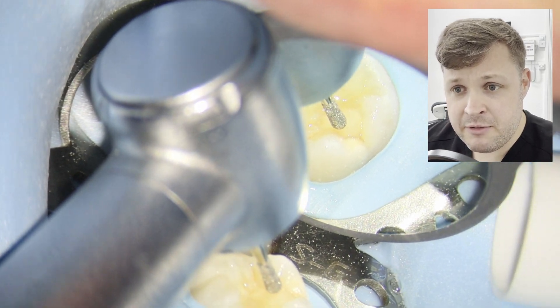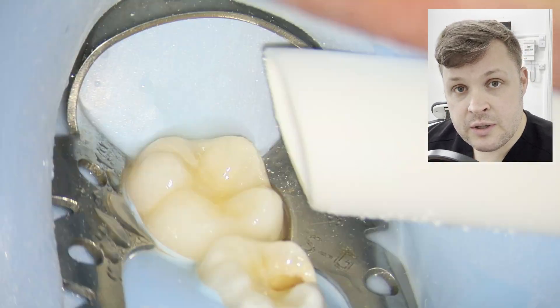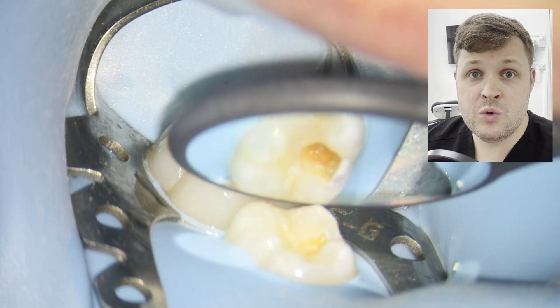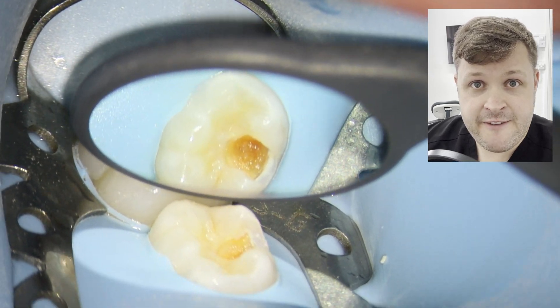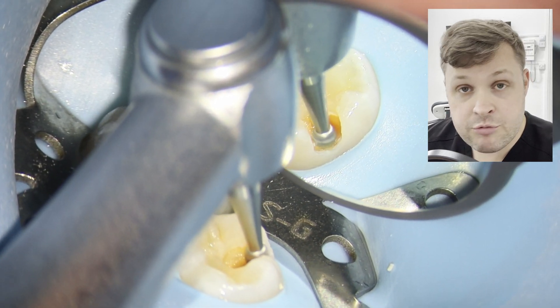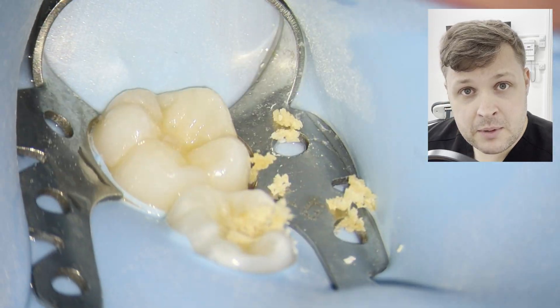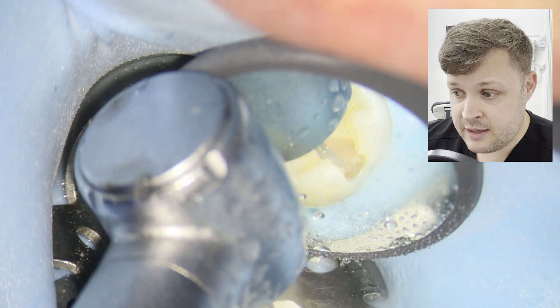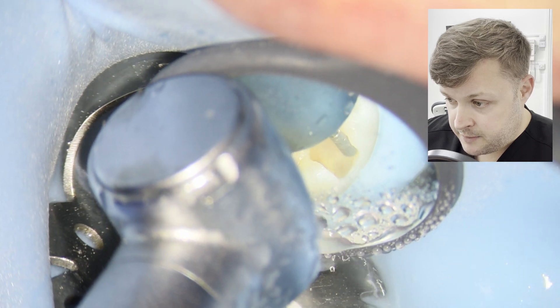I'm looking at the tooth and very gingerly removing a little bit of temporary filling material that was there, assessing how much decay is present. The very last thing I want to do is expose the pulp. With the fast handpiece I'm just removing the undermined enamel — I don't want to take too much away, but enough that if it is undermined it's not going to break.